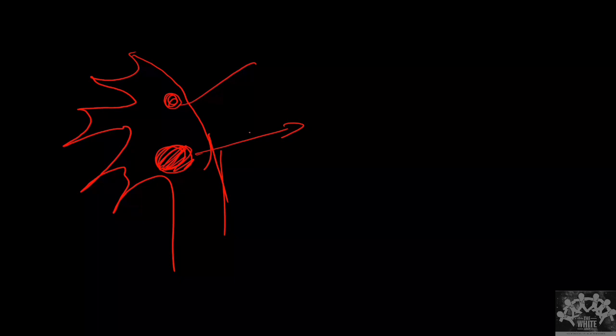Yes, we can tell. Yeah, the lower one is stone, the upper one is air. That's why I drew it like this. The upper one, which is non-dependent, is usually air, and the one which is dependent is usually stone. This is one of the techniques you can use. And then we can use clinical correlation, and then we can use the twinkling artifact. Okay, so this is one thing that you need to remember.